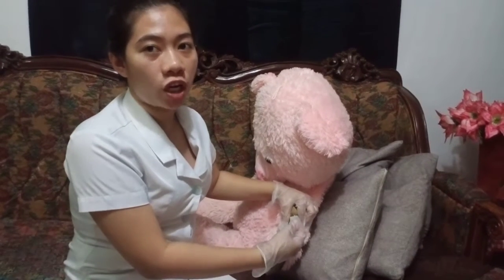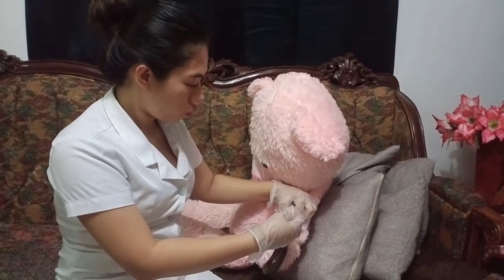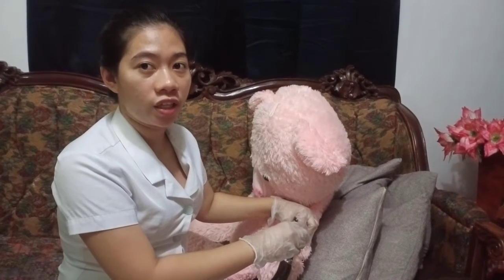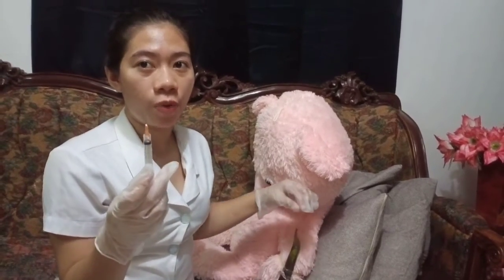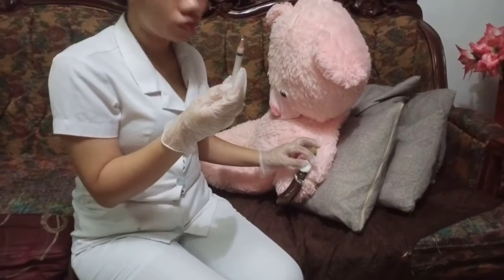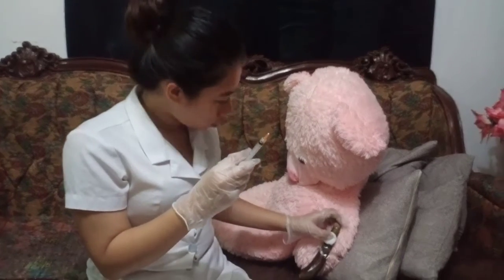So, after injection, wait for 10 seconds if using the ventrogluteal site. Then, withdraw the needle smoothly at the same angle of injection. Then, apply gentle pressure on the site with a dry gauze. Then, if necessary, do not massage the area of the injection. If bleeding occurs, apply pressure with a dry sterile gauze until it stops.